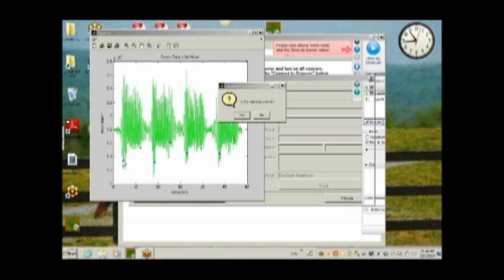And therefore, you might see a selection in this segment and this segment and this segment. However, you may not see a selection being made in this particular segment. Therefore, you can force it to make a selection by increasing that percentage. So in this example, this is a very reasonable selection. If you have chosen to alter the selection, Lameness Locator will continue to prompt you to answer the question, is the selection correct, until you are satisfied, and select yes.